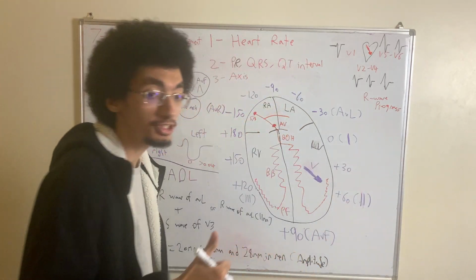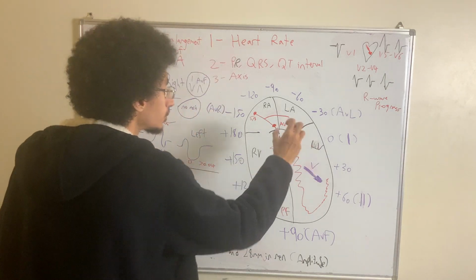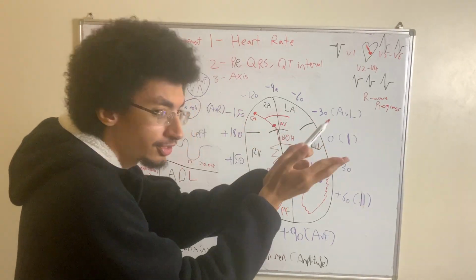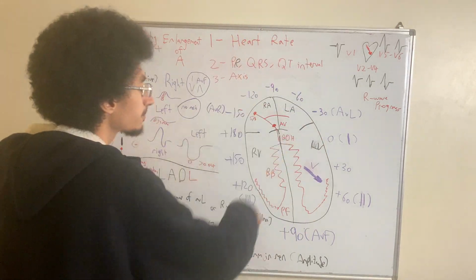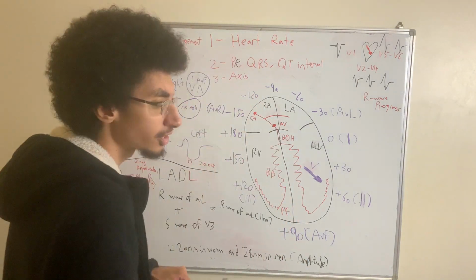So let's say a patient has aortic stenosis. So the left ventricle will contract very hard towards an aortic valve that is stenotic. So the R wave will be very big. There will be a lot of electricity to pump this ventricle, which will obviously be hypertrophied in response to a stenotic valve.